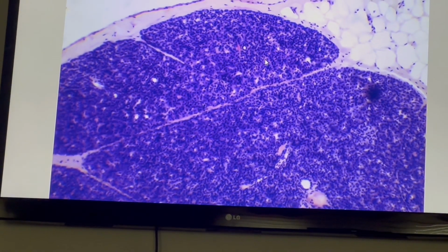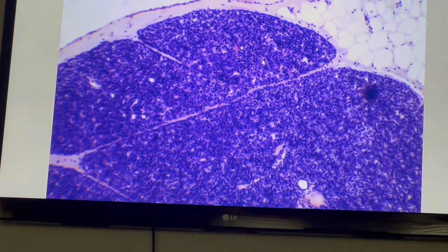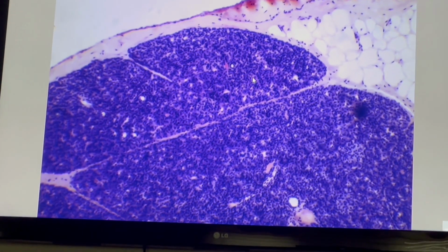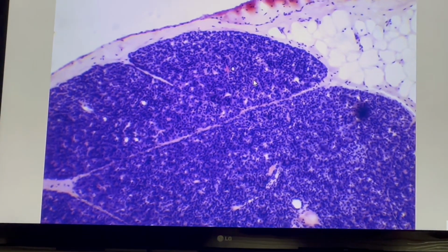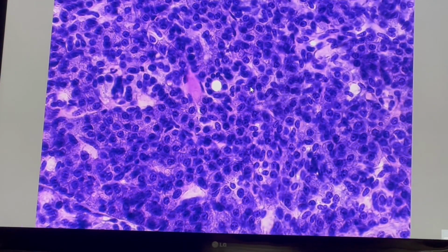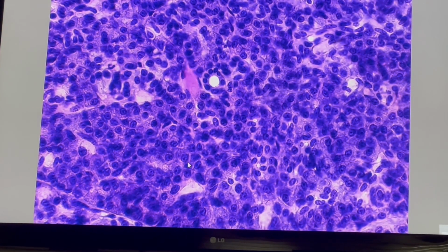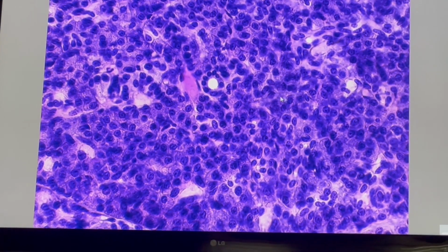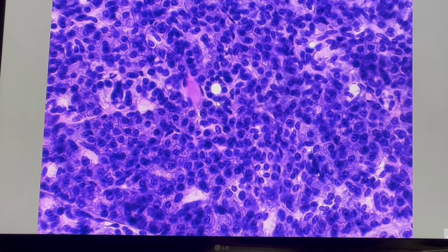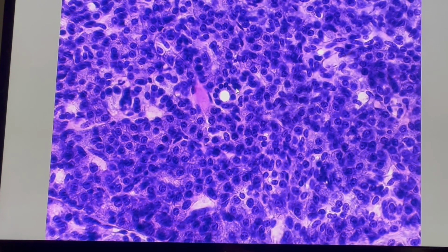The exocrine portion of the pancreas is similar to the parotid gland. So the exocrine portion of the pancreas is a branched acinar gland. These cells are serous cells. We can see serous acini. At the tip of the pointer is the intercalated duct, lined with simple cuboidal epithelium.